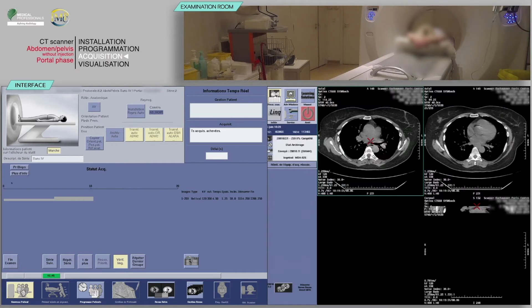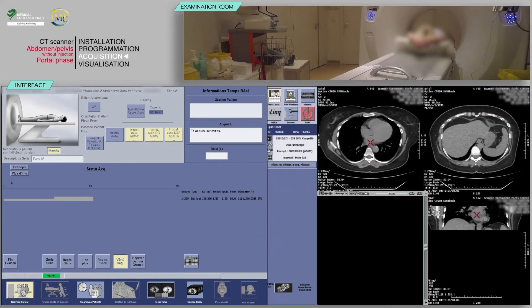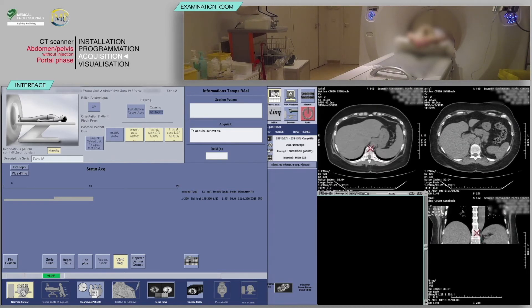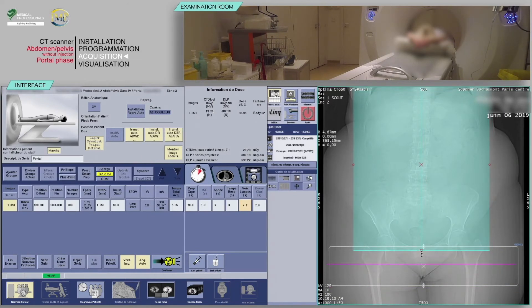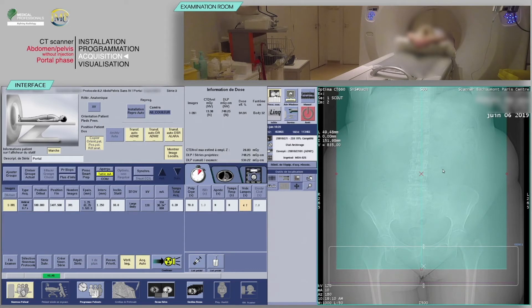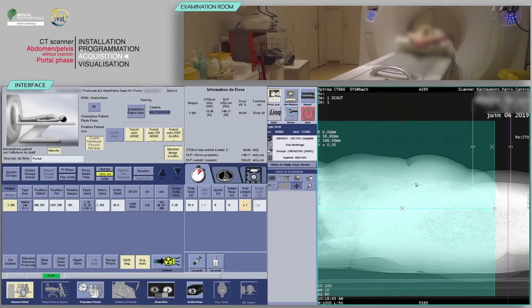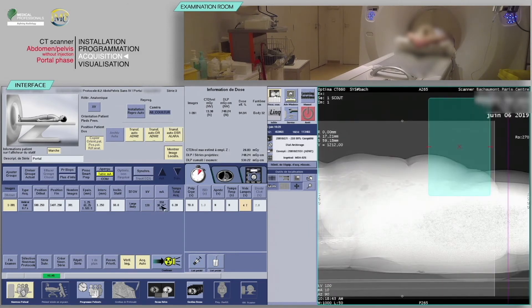Verify the absence of patient motion on that acquisition. For the second acquisition of the abdomen and pelvis with injection at the portal phase, position your slices box to cover the whole abdomen and pelvis from above the diaphragm to the inferior border of the ischial tuberosities on the AP scout view. On the lateral scout view, place the slices box at the mid-thickness of the patient. Note that in order to obtain imaging at the portal phase, a delay should be added to the start of the scan — approximately 60 to 70 seconds would be appropriate.